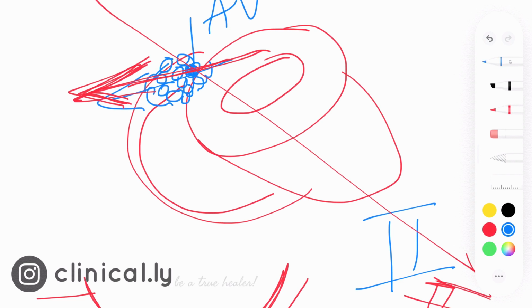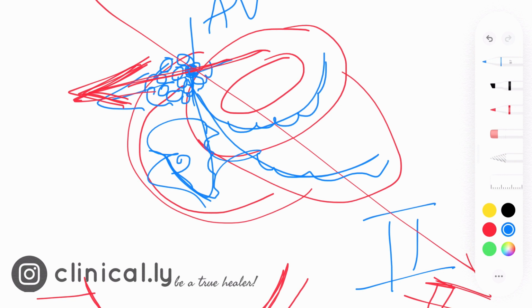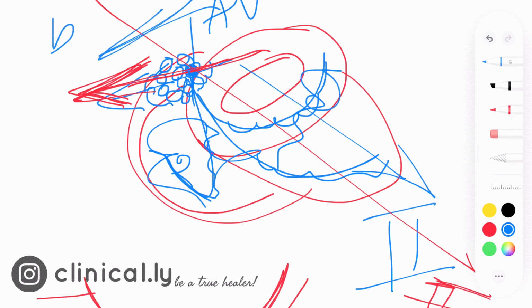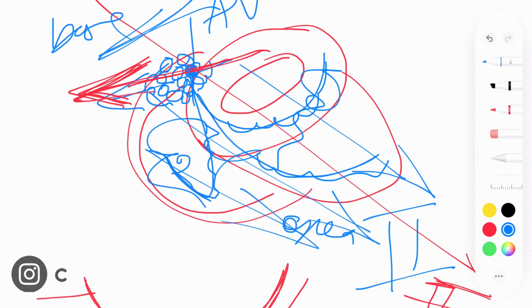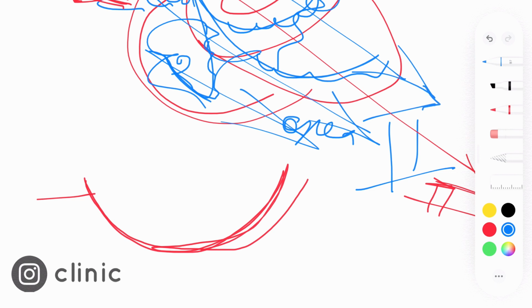Quickly the wires take the current to the right ventricle as well as the left ventricle, and multiple cardiomyocytes initiate wavefronts which then start covering. The sum of the vectors of this activation is directed from above, from the base to the apex, in this direction. So a very large voltage wavefront is created and the vector is directed towards lead 2.